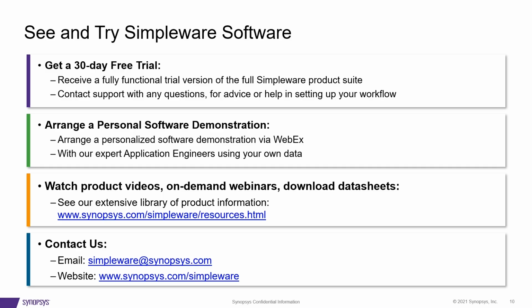Yes. Okay. And also the landmarking. We mustn't forget the tool has automated landmarking in addition to segmentation. Do you use that functionality currently? The landmarks I use especially for applying the boundary conditions. So I need to find the epicondyle center, and the software directly gives the medial and lateral epicondyle center. So I just need to take the average to find the central part. Excellent. That's good to hear.